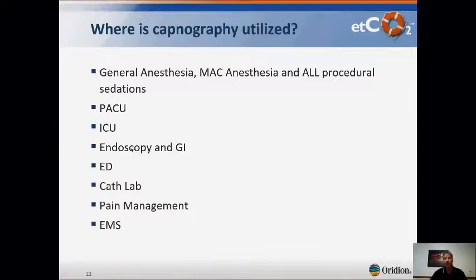We've talked about our big marketplace, endoscopy and GI. Probably 5 to 7 years ago, they weren't monitoring endoscopies routinely. They were literally using their hand to feel breath being exhaled from a patient, or they were watching and observing chest movements. Well, the problem is a lot of times they're dimming the lights, they're putting the patient in a position you can't really see very well, and as a result you had issues with patients not breathing and them not catching it right away. Whereas now, if you have a CO2 monitor, as soon as that patient quits breathing because they're over-sedated, you'll see the CO2 waveform go flat, and within 15 to 20 seconds, you'll get an alarm alerting you to the fact that you need to shake the patient, stimulate the patient, open their airway, or rescue them if you have to.